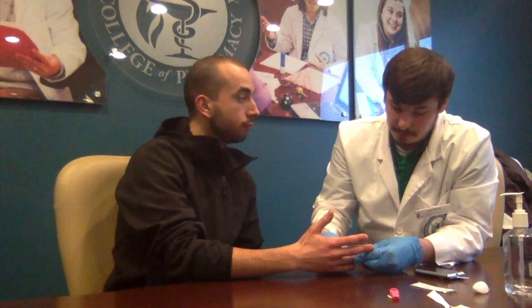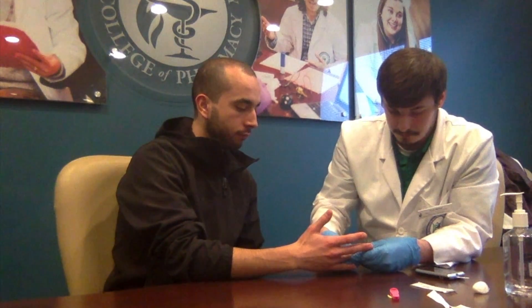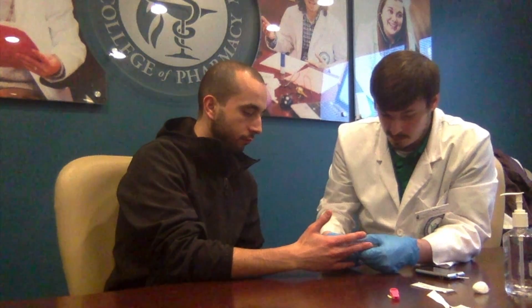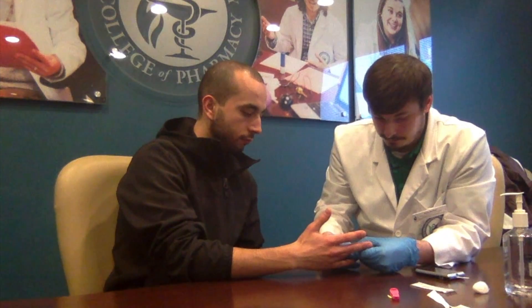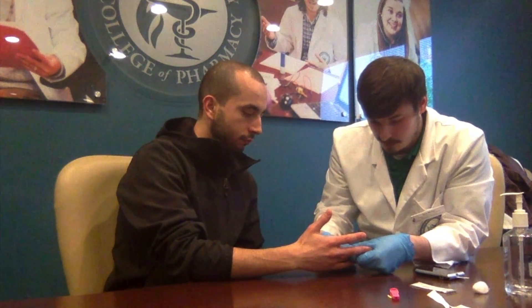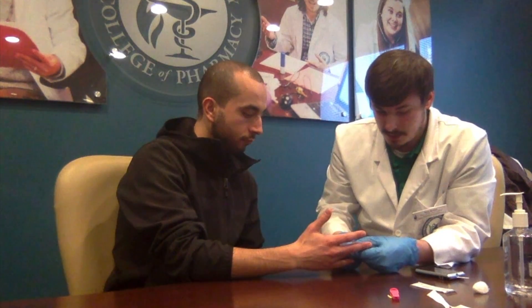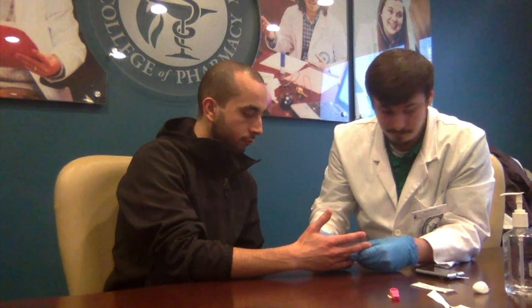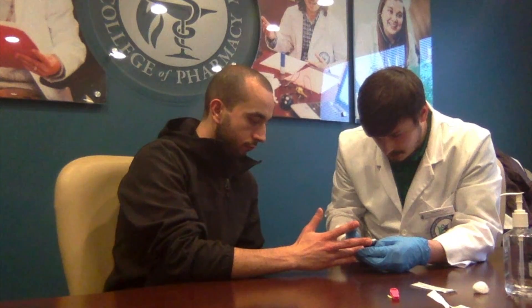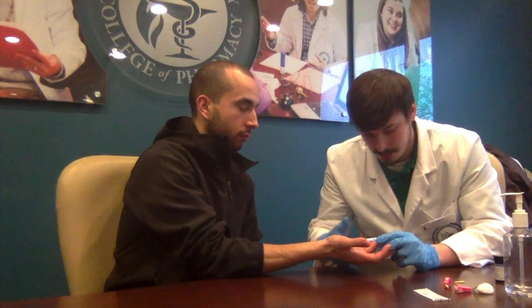What I'm doing now is massaging the finger to get some more blood for the glucose meter. Once you get a decent amount — about that size — take your test strip and it just sort of sucks it up like a straw. You'll hear that sound and you'll get a countdown.